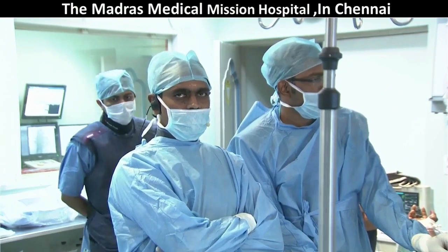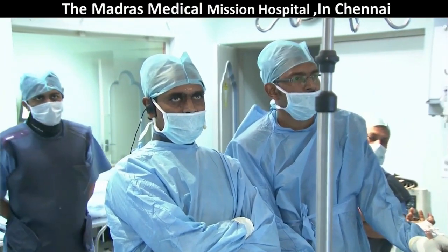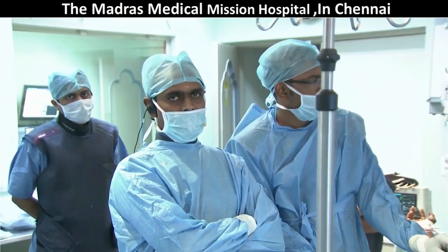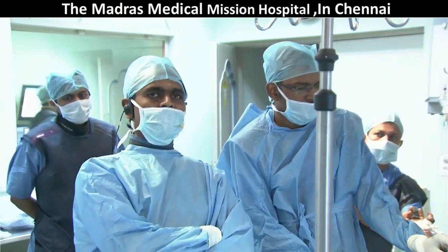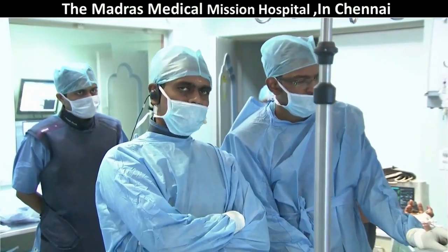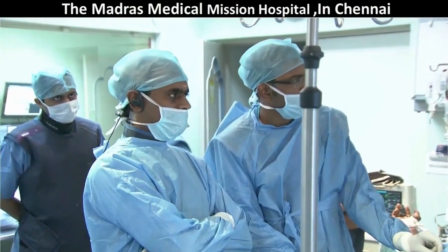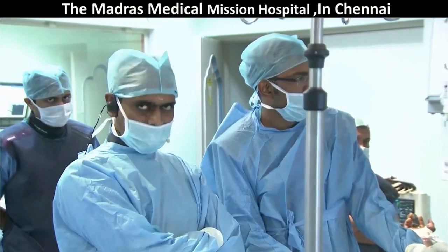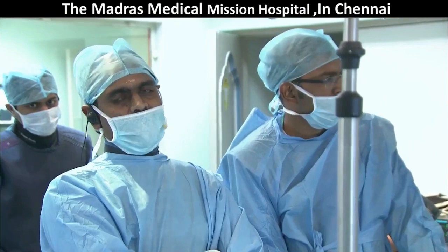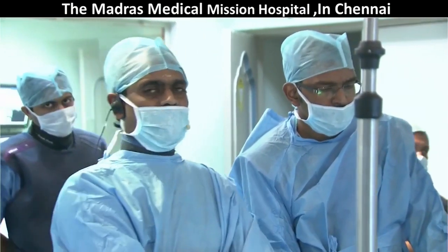Yeah, this is a great case. You have good margins all around, posteriorly, inferiorly, anterior. Exactly. Even aortic has got a good margin actually, and it's quite circular rather than oblong. Exactly. And so the ASD is measuring around 21 to 22 millimeters.